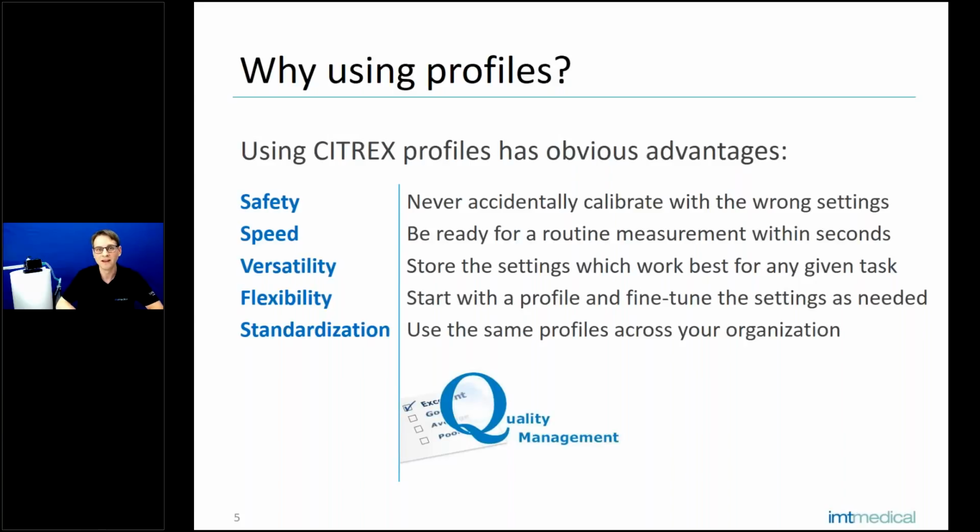The second one is speed. I think you all know it sometimes takes quite a lot of time to set up your device and make all the settings for your next measurement task. By using profiles, this is just lightning fast. Within seconds, you will be ready for your next measurement task.